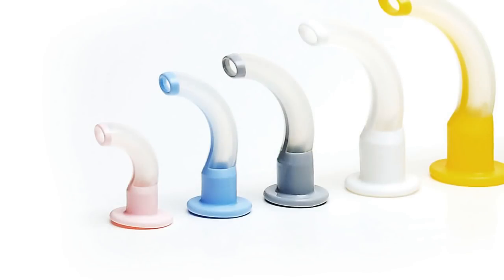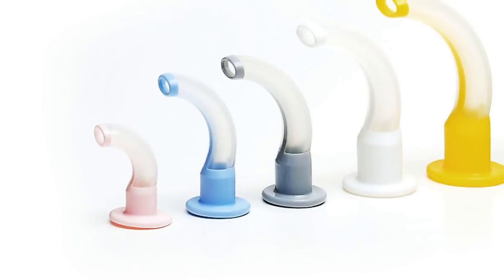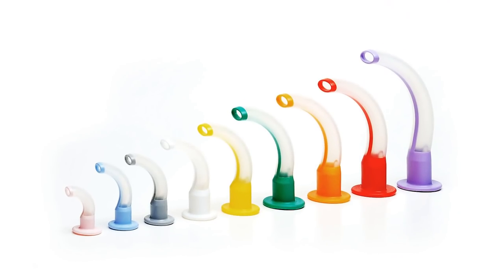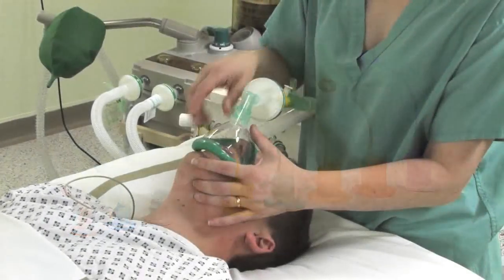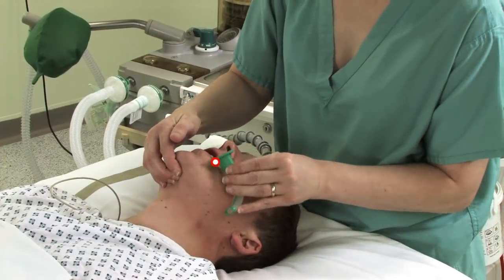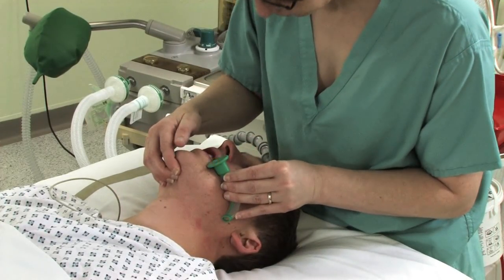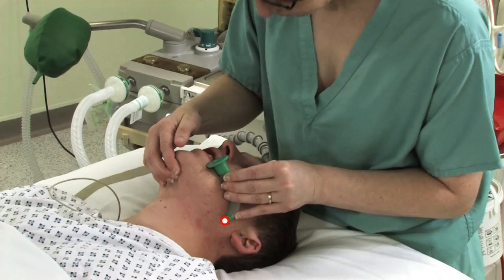Oral pharyngeal airways come in a variety of sizes from size 000 to size 5. The appropriate size is determined by placing the airway adjacent to the patient's face with the flange at the corner of the mouth. The tip of the airway should end approximately at the angle of the jaw.